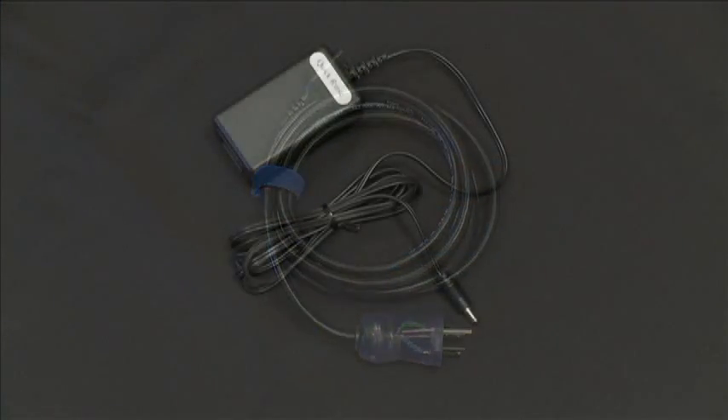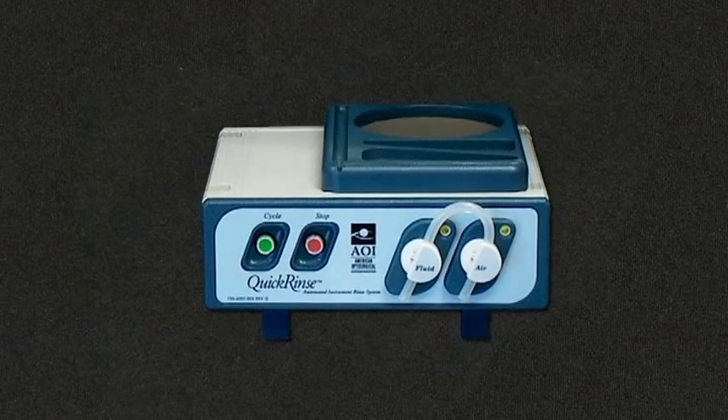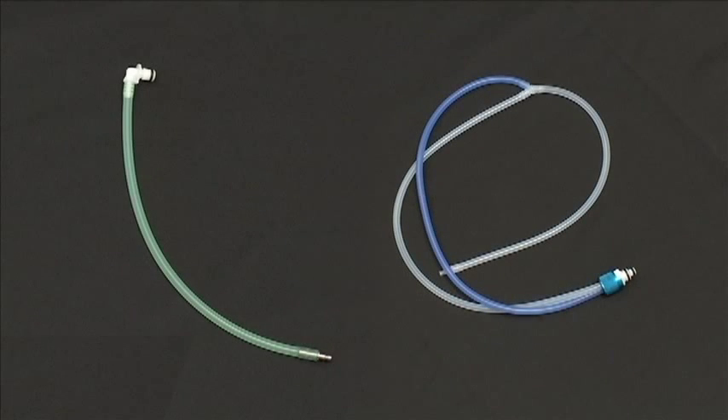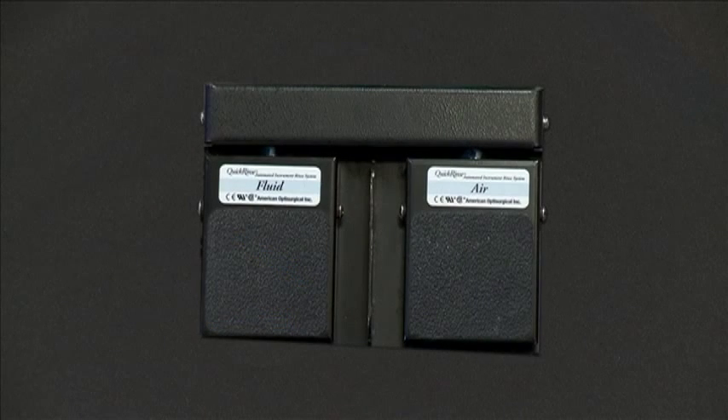Power cord, power supply, Quick Rinse unit, bottle with bottle cap, accompanying tubing and connectors, and accessories pack consisting of lure adapters, miscellaneous nozzles, and wire brush. If you purchased the optional foot pedal, that will be packaged as well.